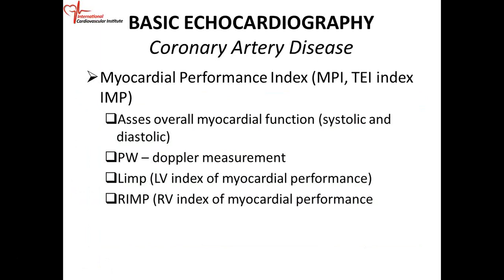And you need PW measurements, okay? The full description of this is left ventricular index of myocardial performance, and you need to know the definition.